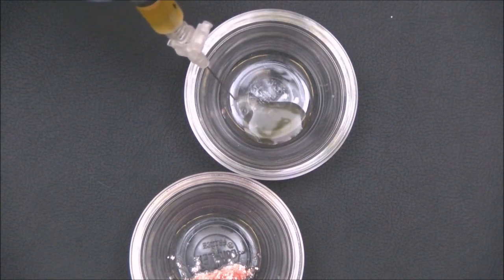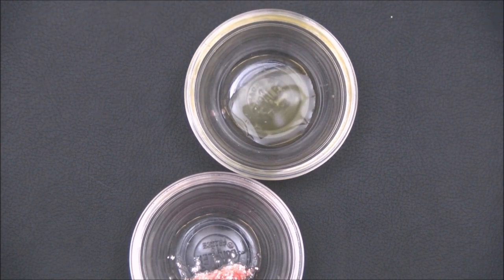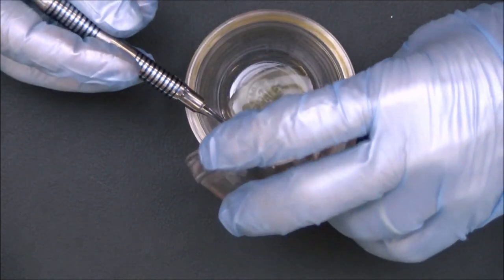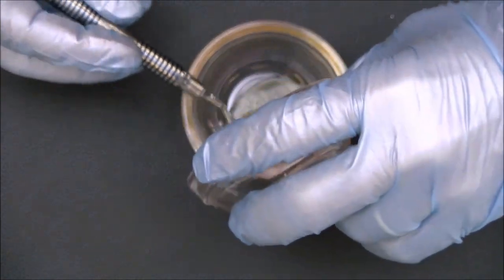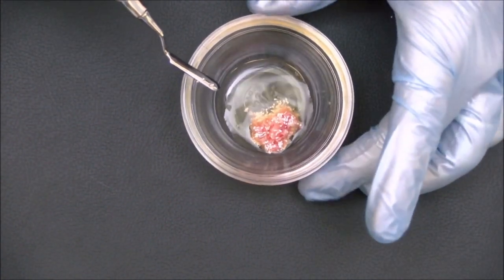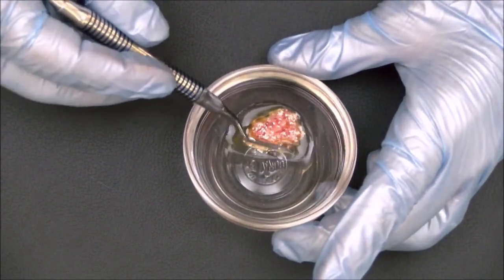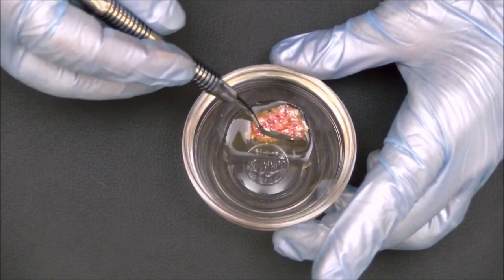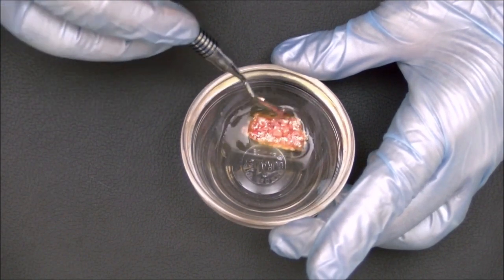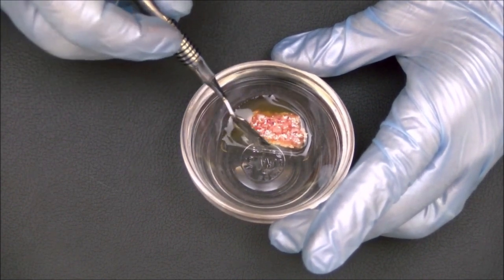Into a second sterile dappen dish, we then place one cc of the plasma harvested from the white top tube. The bone graft is then added to the plasma, and gently manipulated to make sure that it is completely immersed within the plasma. The coagulation cascade takes place after only 15 to 20 seconds.